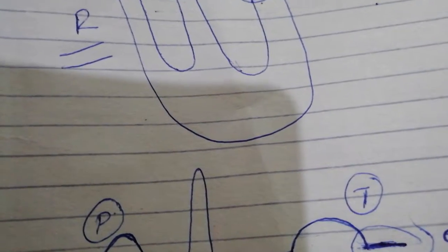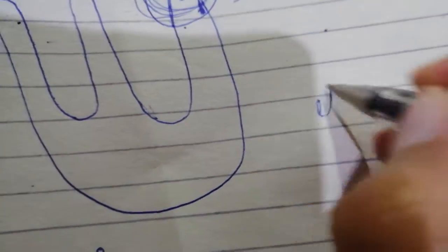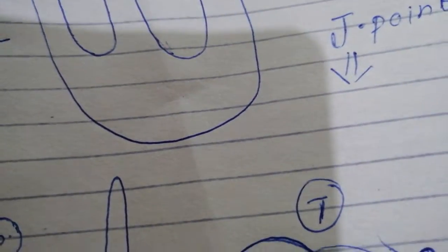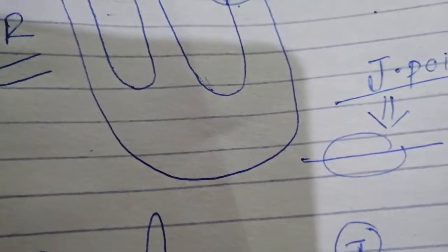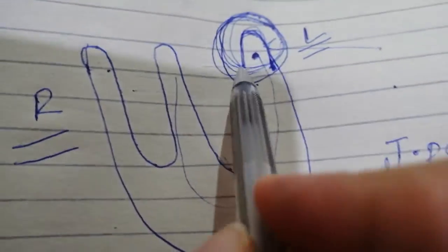So before you can understand or locate where the current of injury is, you have to figure out where the J point is. The J point is the point where, whether current of injury exists or not, zero baseline is achieved, because it is the point where the whole of the ventricle is depolarized. Obviously this part will also be depolarized because it is always depolarized.